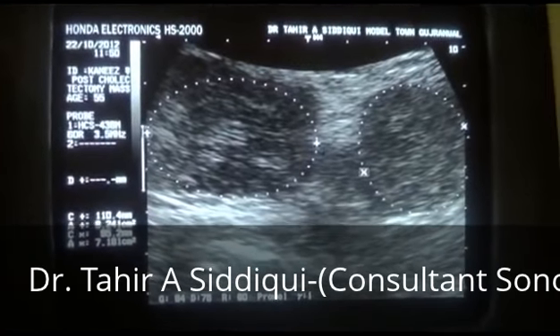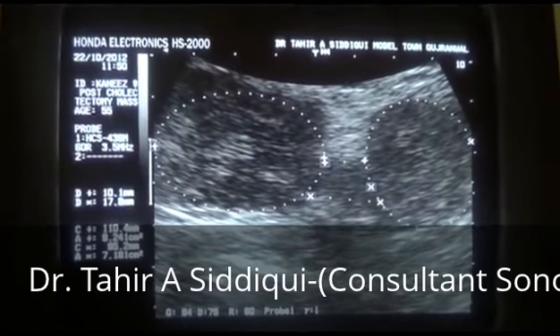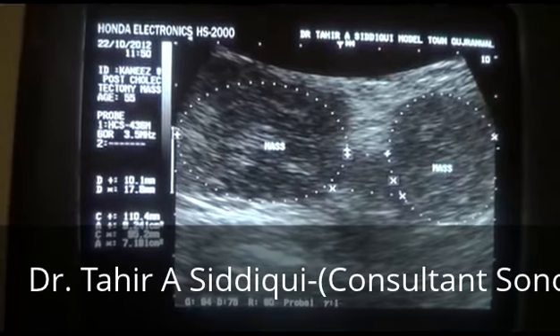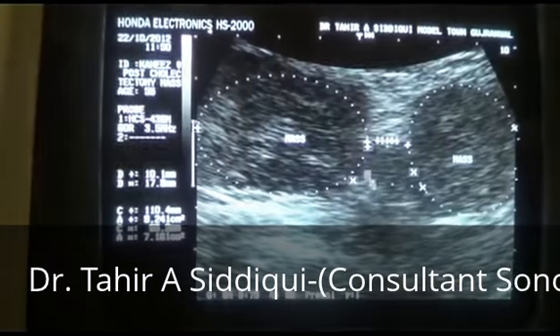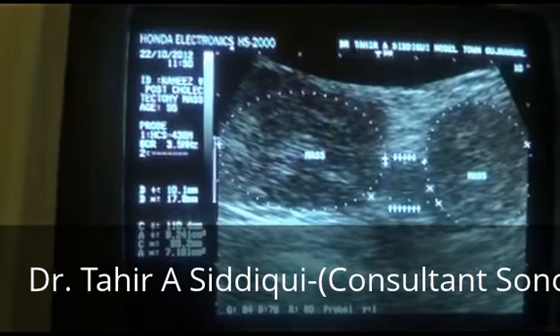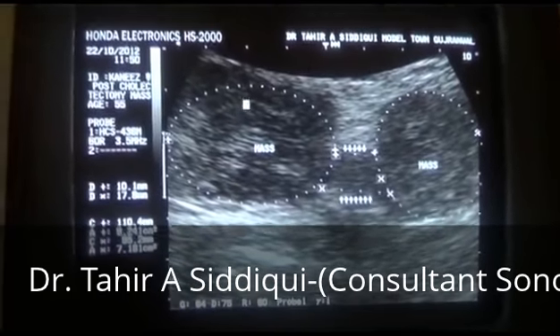And here is the communicating point between the two subcutaneous collections. Here is the communication between these two mixed echo, relatively solid masses which are in the subcutaneous tissue.